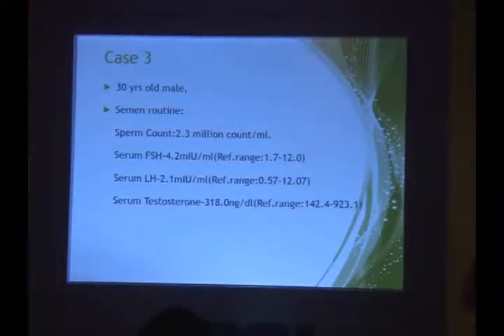So in other words, what is the significance of a positive HOS? That means these are viable sperm. What is the clinical utility?